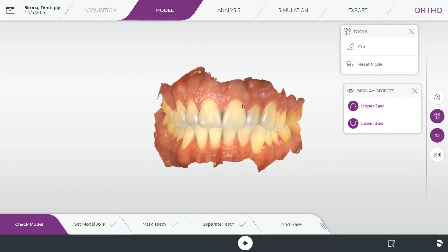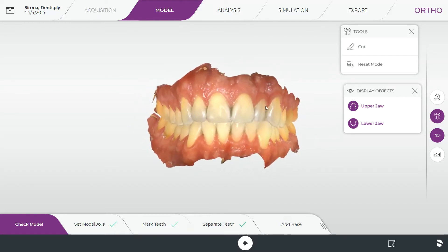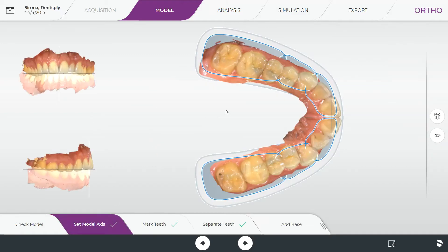We're in the model tab right now with a scan already preloaded. You can cut the model to trim it for any artifacting or tags you might not like. These are steps you need to complete before the analysis tab or simulation tab become accessible. Setting the model axis — the software does a very good job of this on its own, but always worth checking. We're looking for the horizontal line to be roughly on the occlusal plane and the vertical line splitting the central. Everything looks pretty good here.